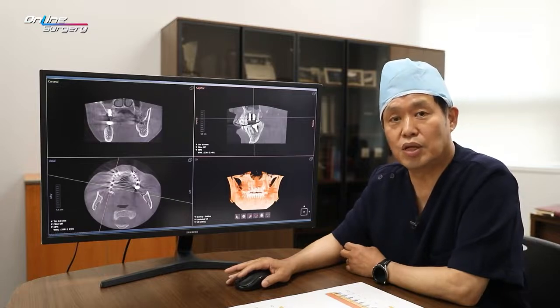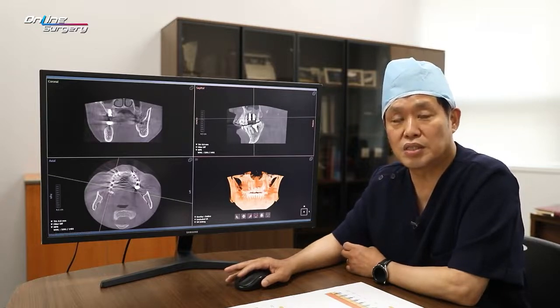completed. In this surgical video, I hope you understand and focus on the drill sequence and stopper. I believe it will be of great help to you. Please enjoy the video clip.